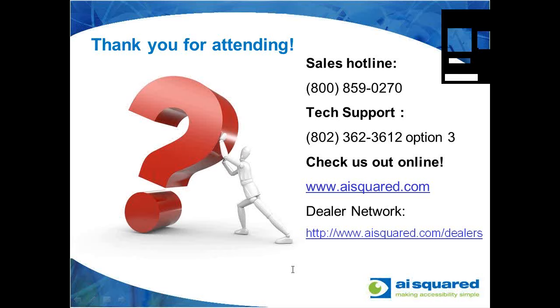Like I said, you're welcome to use your own. I would just stress that the camera stand is going to make it much, much easier to use. Now, someone else had a question about using the camera with the dual monitor feature in ZoomText. This is only going to work on one monitor, so there's no way to put the camera view on the other monitor, for example. It's something that we're considering for future versions of ZoomText, but right now the camera view is only going to show up on the primary display.